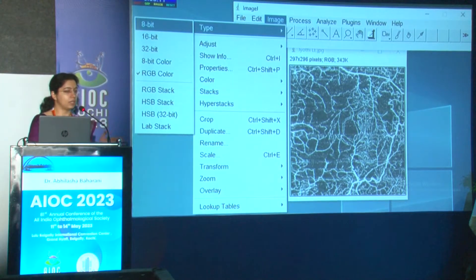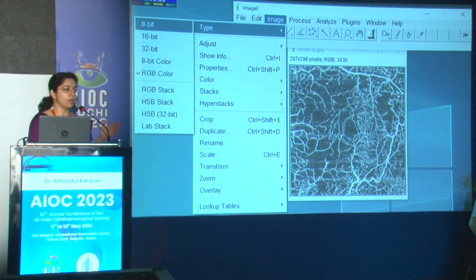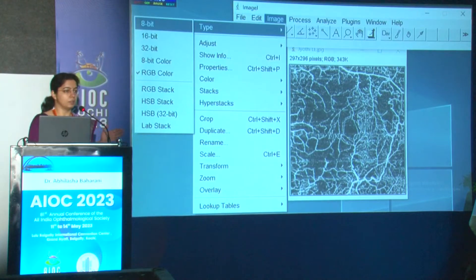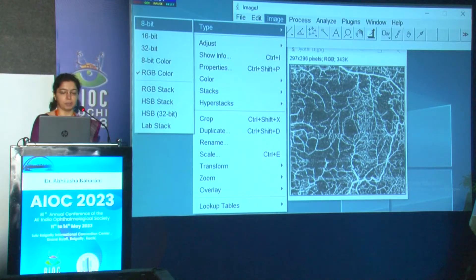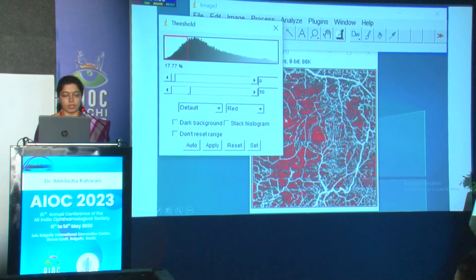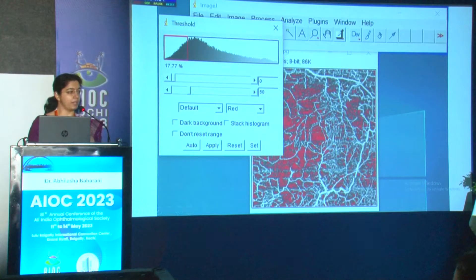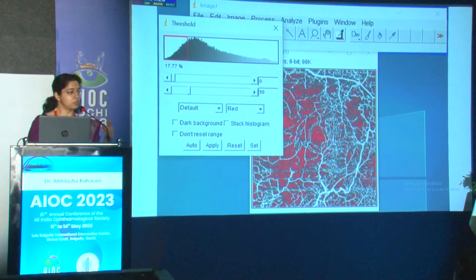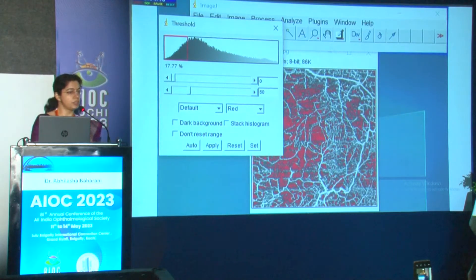In an 8-bit image, 0 is black and 255 is white. Traditionally, ImageJ software is used to binarize the image — so you have either 0 or 1, with no in-between. But we all know that OCTA has a lot of artifacts; with eye movement, motion artifacts may come, and the 0 and 1 may not actually be correct. So you get this 8-bit image and then apply the threshold function. The threshold I have applied in this image is 50 — so from 0 to 255, I have applied 50, meaning all gray levels darker than 50 are selected. This threshold can then be applied uniformly for all patients with a particular disease entity, allowing comparison of ischemia levels.